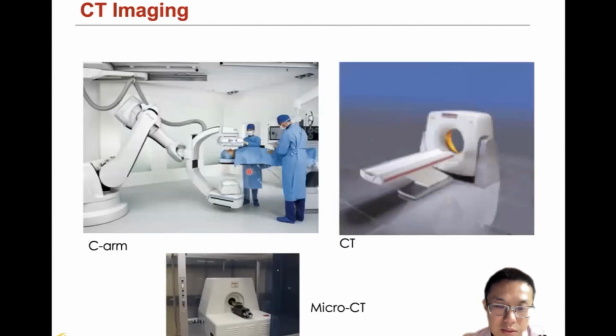And for the imaging facilities or systems, we have different CT imaging systems, right? So we have the C-arm. Basically, this is not a closed circle, just like a C, like a half, right? The patient can be put under it and we take some images of the brain or maybe other parts. Okay, and mostly we have these donut-shaped CT machines. The patient lies on this table, goes through this machine, and takes the examination.